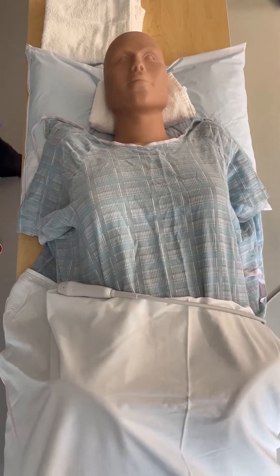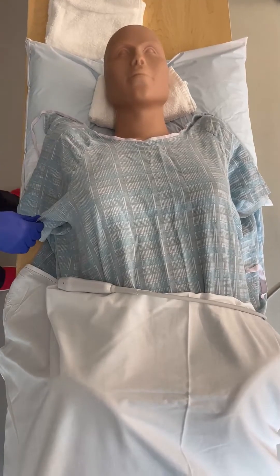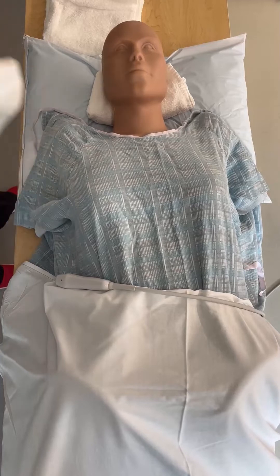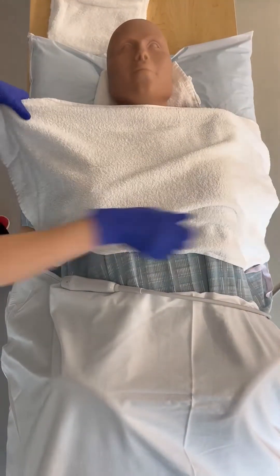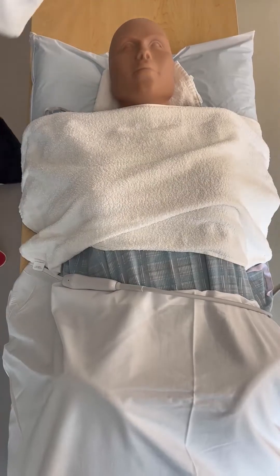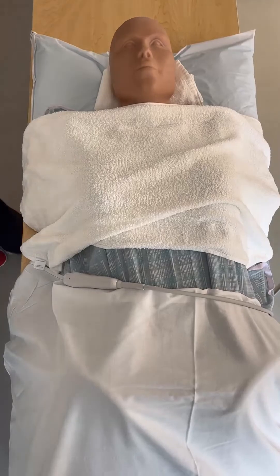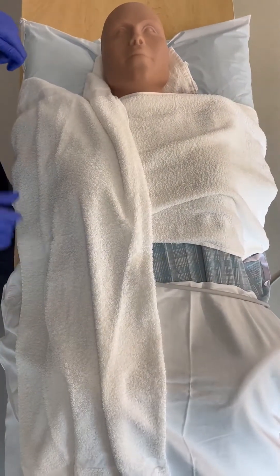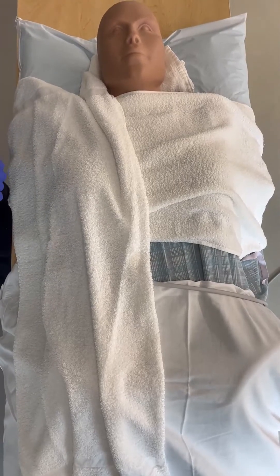Here we have a patient with breast tissue and we are going to do a cardiac ultrasound. You'll want to start out with the patient in a gown, then we'll use two towels to continue to drape the patient. The first goes horizontally across the patient's chest, and the other goes vertically head to toe across the right side of the patient's chest. With these three in place — the gown and the two towels — we'll be able to keep the patient covered while we get all of our cardiac views.